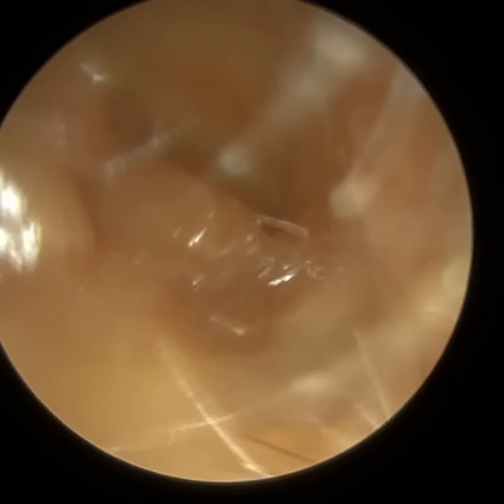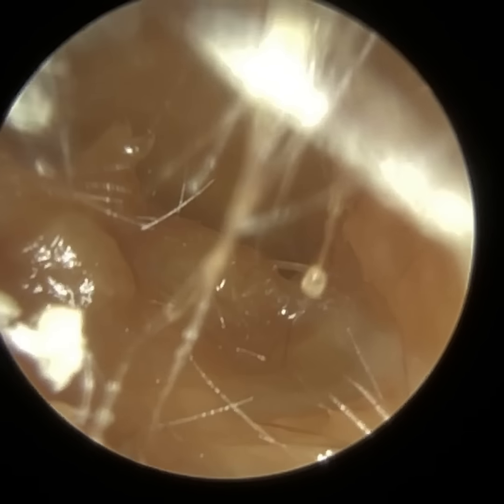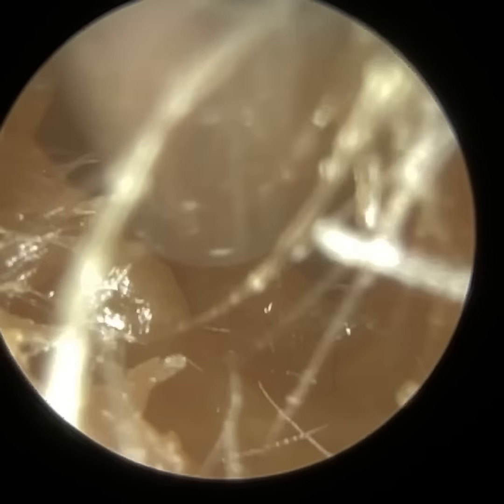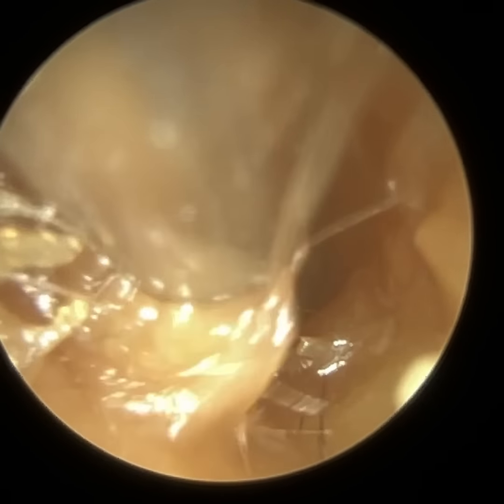Thank you for joining me in my latest video using the iClearScope endoscope. And this is of a patient's left ear. I previously uploaded their right ear procedure earlier on in the week, and that was video number 1553. And I said I would upload their left video separately because both procedures took quite a while.